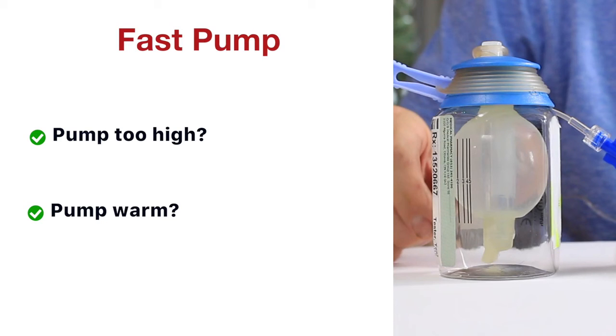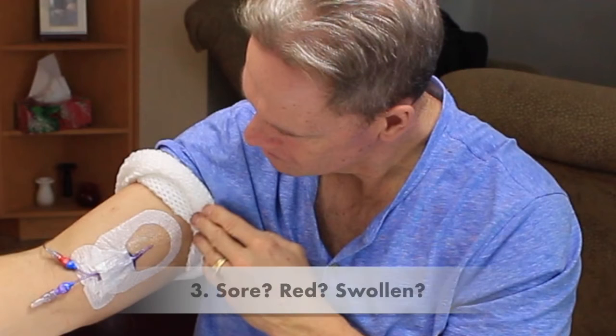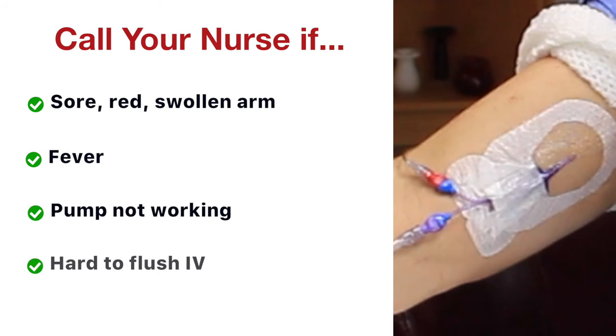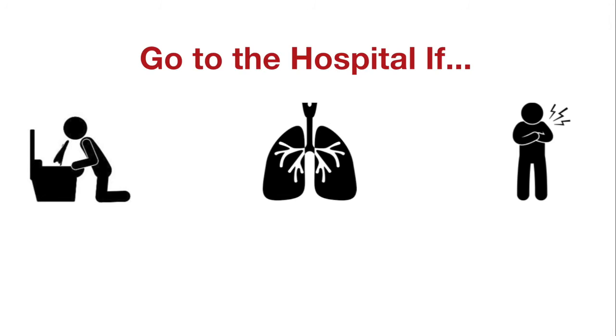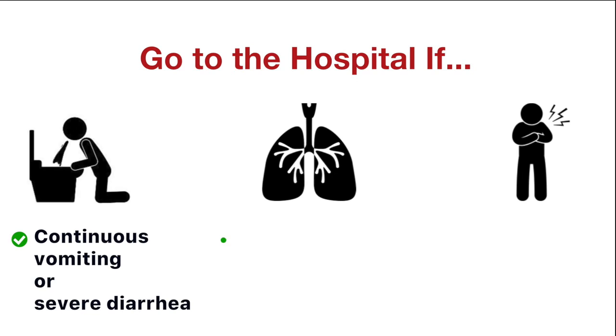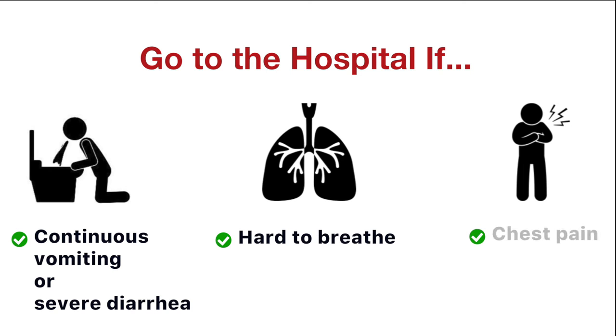If your arm is sore or reddened or there's some swelling, if you develop a fever or it's hard to flush, or if your pump isn't working, then you need to call your nurse. But you may need to go to the hospital if you have a lot of vomiting or severe diarrhea because of the antibiotics, or if it's hard to breathe, or if you get chest pain.